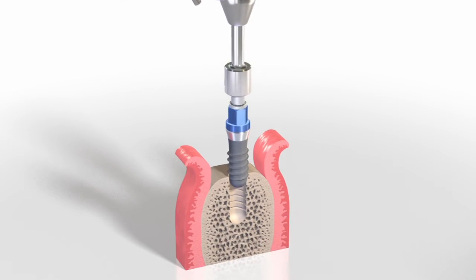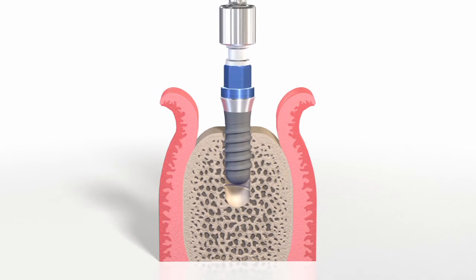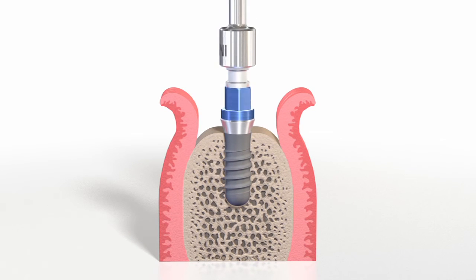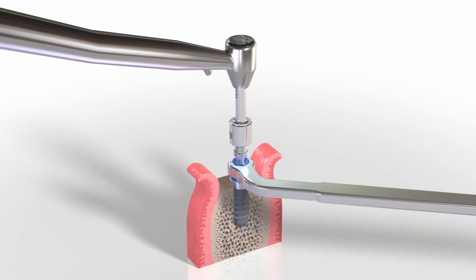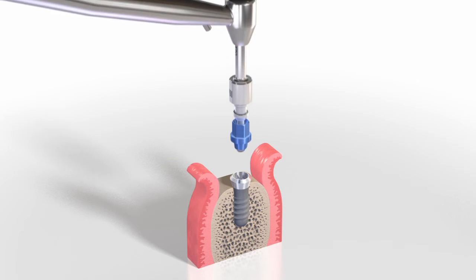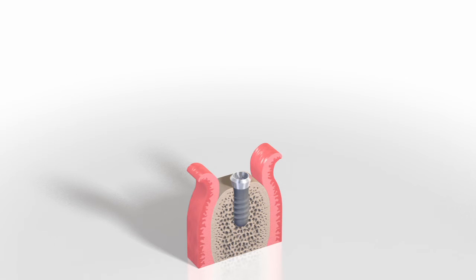Then the implant is moved to its final position by turning it clockwise at a maximum speed of 15 RPM. When the floor of the bone cavity is reached, there's a perceptible increase in resistance. Before the transfer part is removed, the motor is set to reverse. During the first few turns, the transfer part should be held firmly with the holding key that is stabilizing the hexagon. The transfer part is then removed.